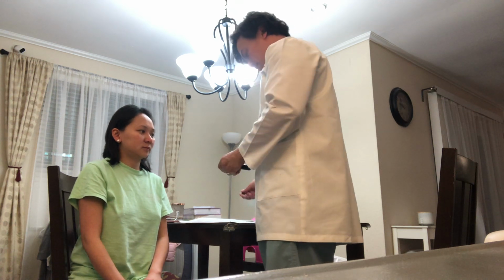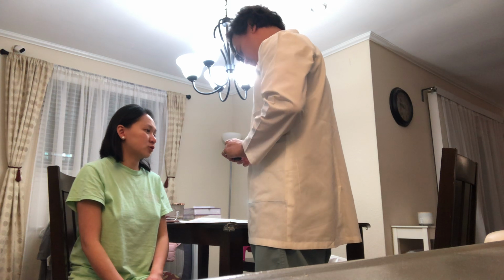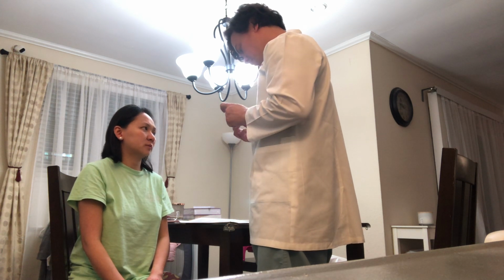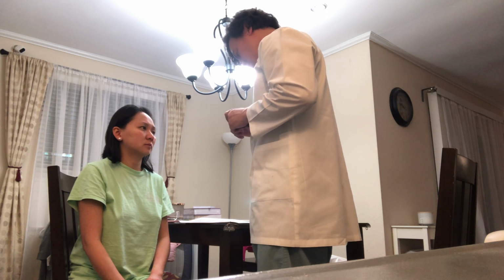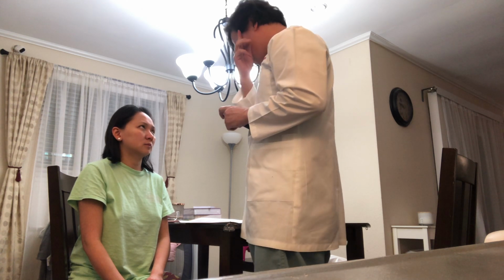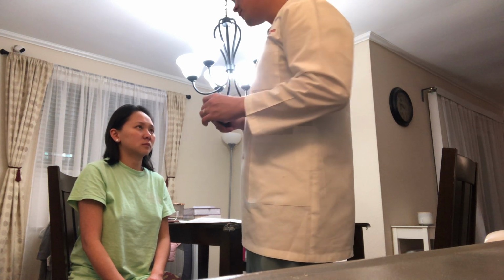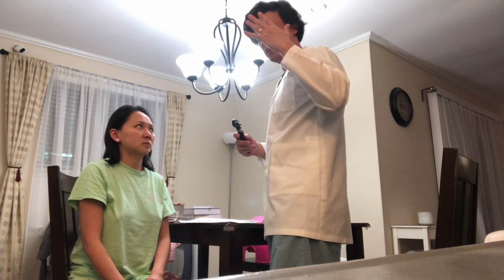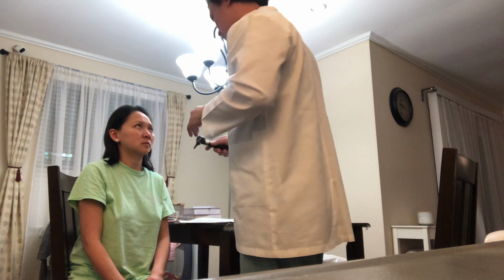So with the otoscope, you inspect the inner ear, and then you check the tympanic membrane. It should be pearly white, and then you check for the light reflex.